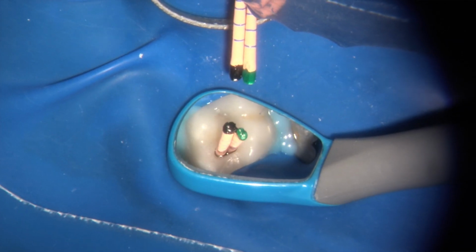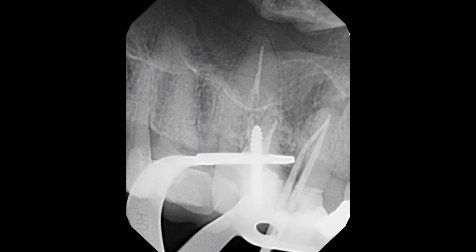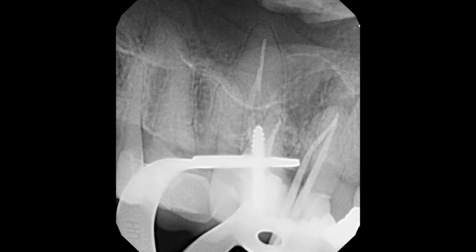And then again, expose another radiograph, and we can see here the MB2 joins the MB1, and that's fine. Part of the reason why these types of cases fail, despite the fact that the MB1 joins the MB2, and the reason why it took so long for this case to fail, is because the tissue that was left in the MB2 and was untreated takes a while to become necrotic and work its way around the MB1 to cause the infection. That's part of the reason why, whether MB2 joins MB1 or not, it should always still be cleaned out adequately and completely before we proceed.